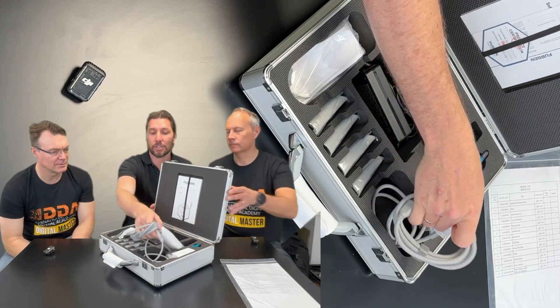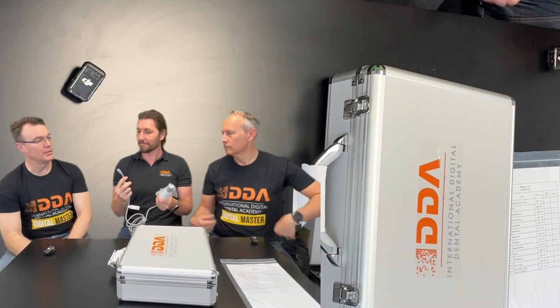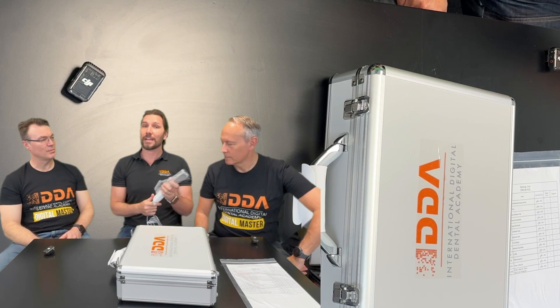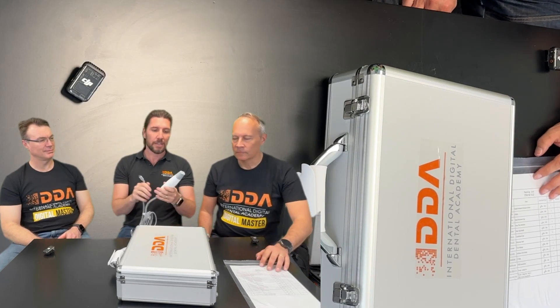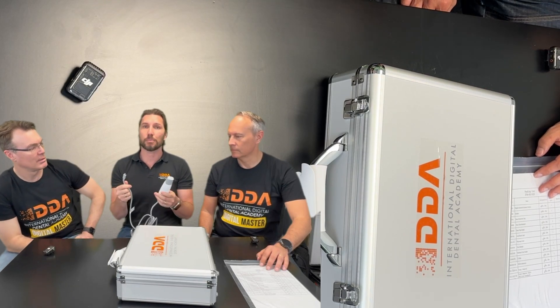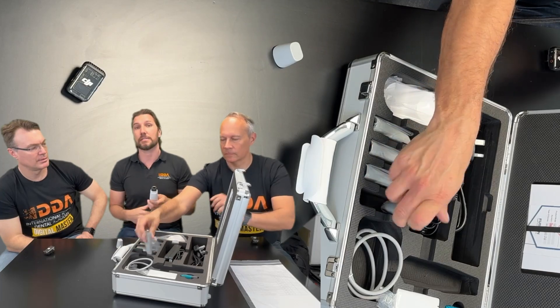One of the main things that we changed with this — let's take it out and have a look. What do we have at the end of this? USB-C. So that's it. That's your scanner. We can just plug that into a computer with a USB-C, pop the tip on, and that is it done.